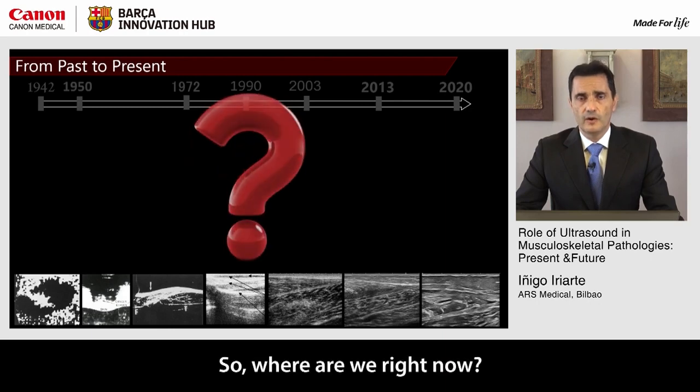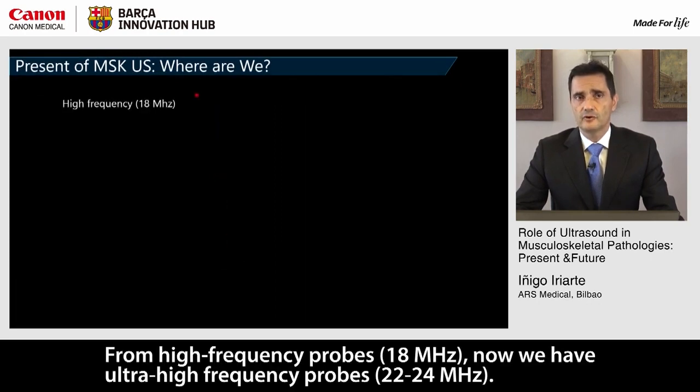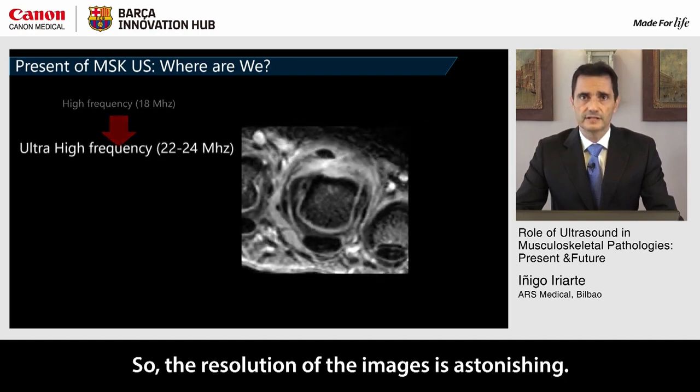So where are we right now? From high frequency probes of 18 MHz, now we have ultra high frequency probes, 22, 24 MHz, but usually in MSK we use 20, 21 MHz. So the resolution of the images is astonishing.